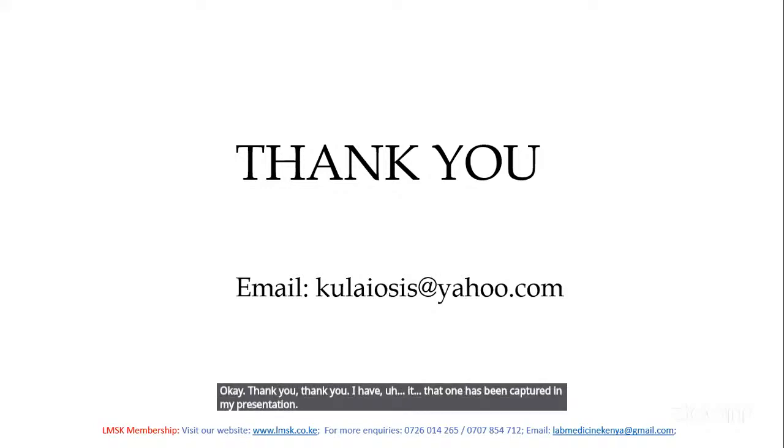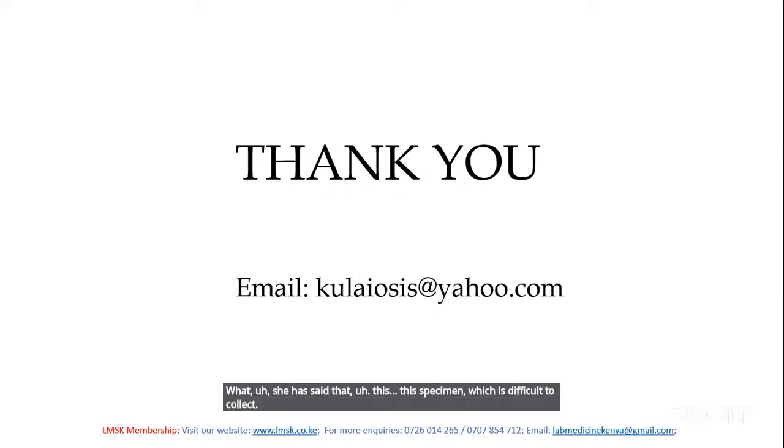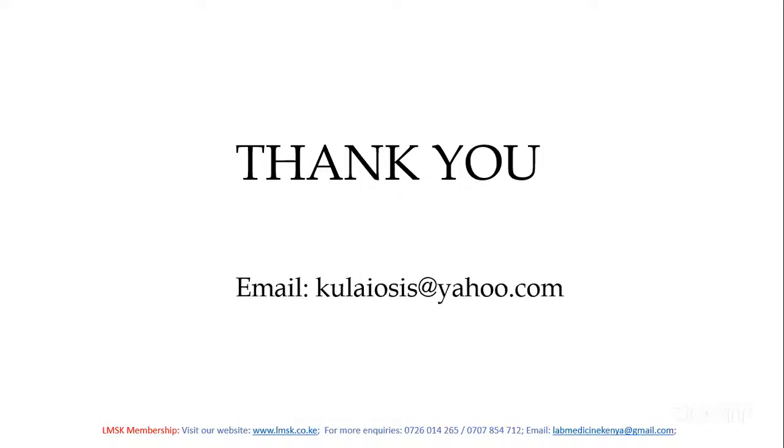There's a slide which says that we reject unlabeled, mislabeled specimens, but there is an exception. The specimens which are difficult to collect, like CSF and bone marrow, there is an exception.